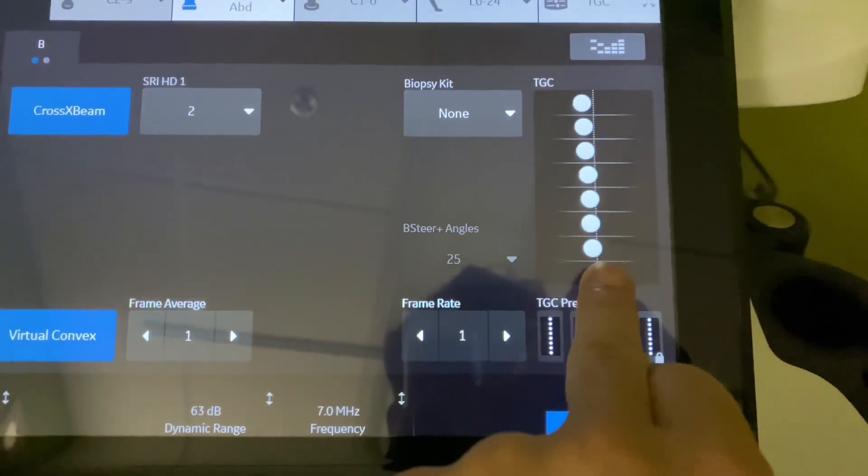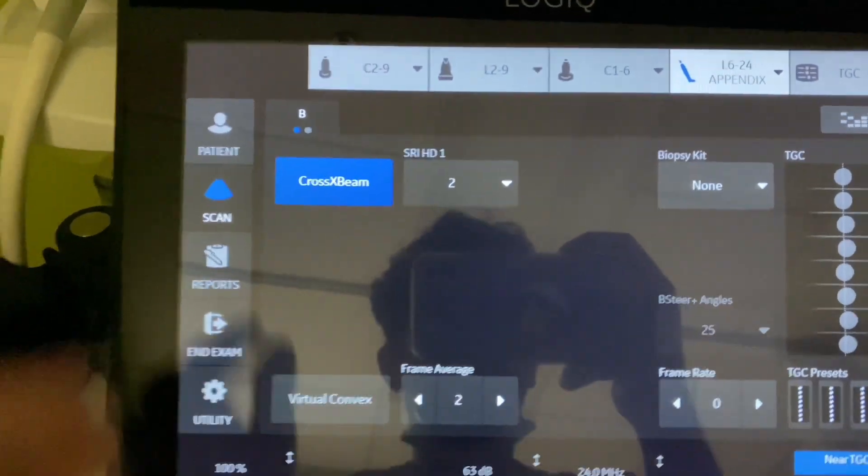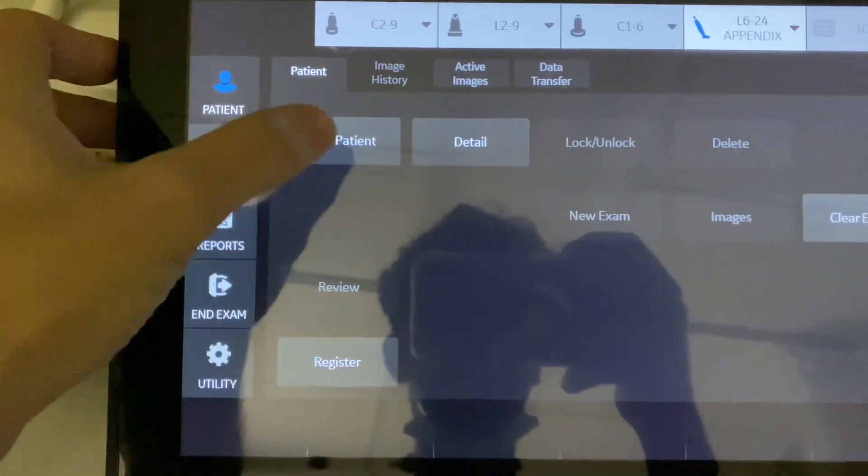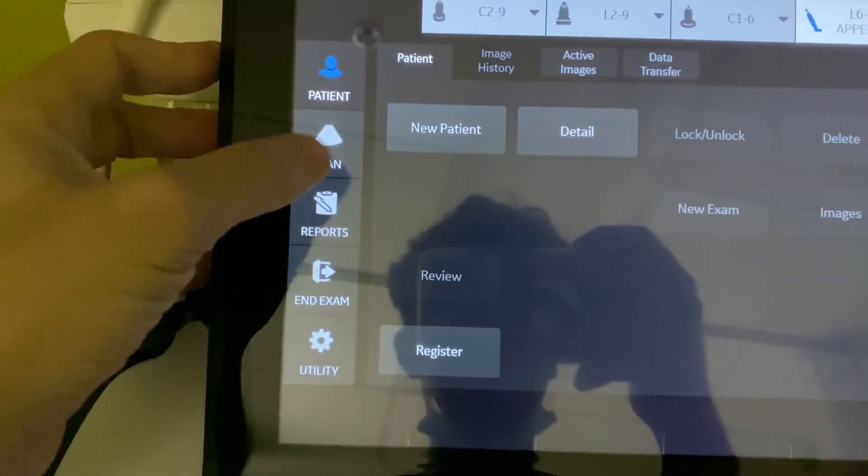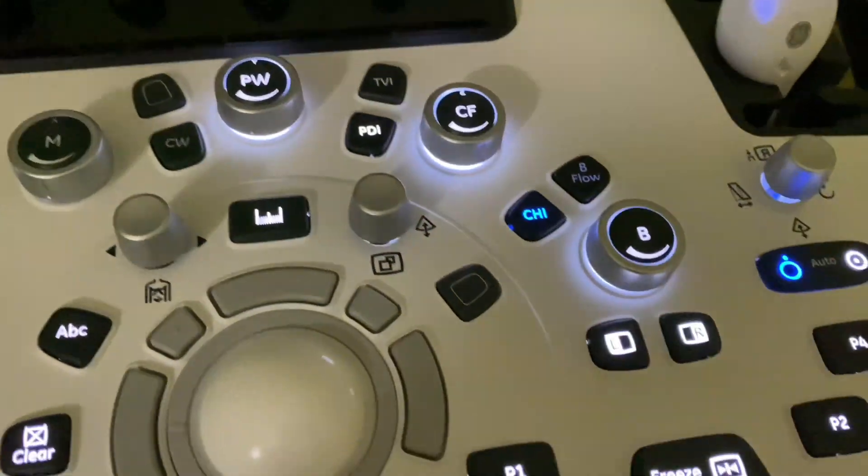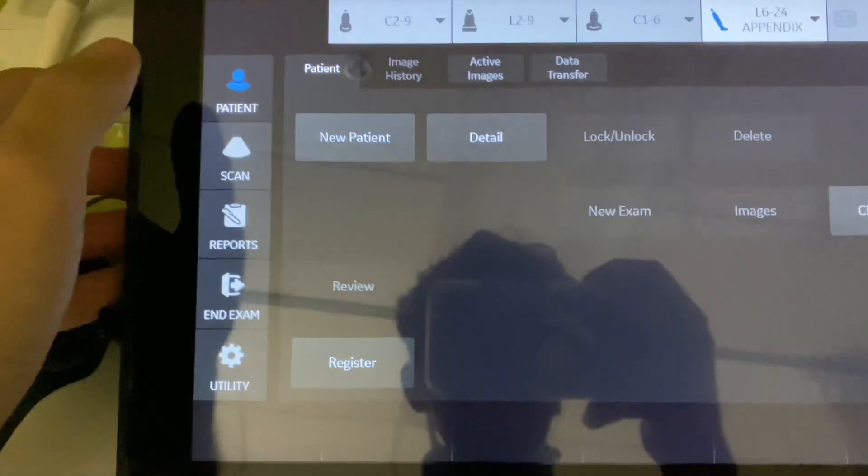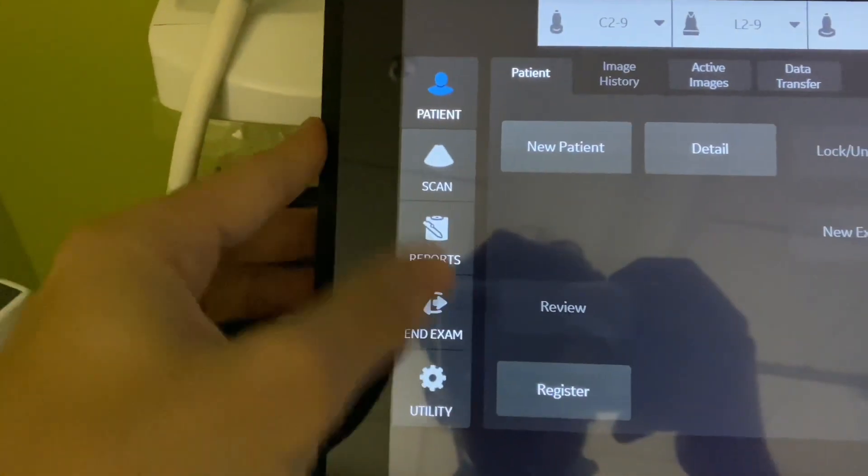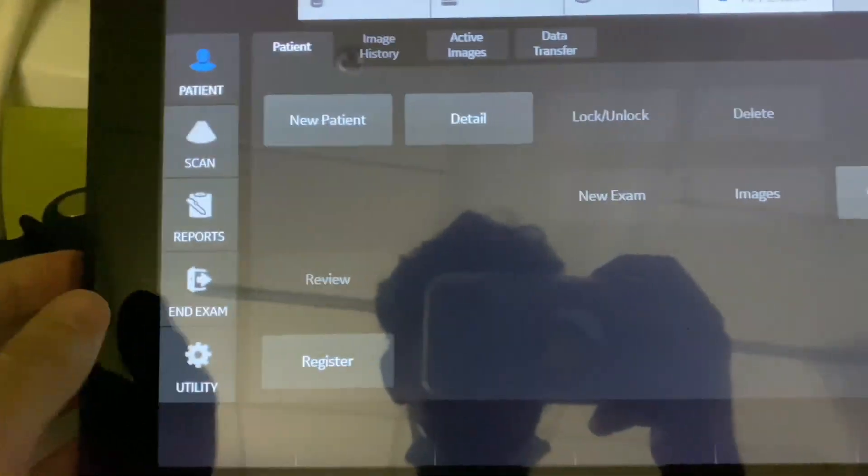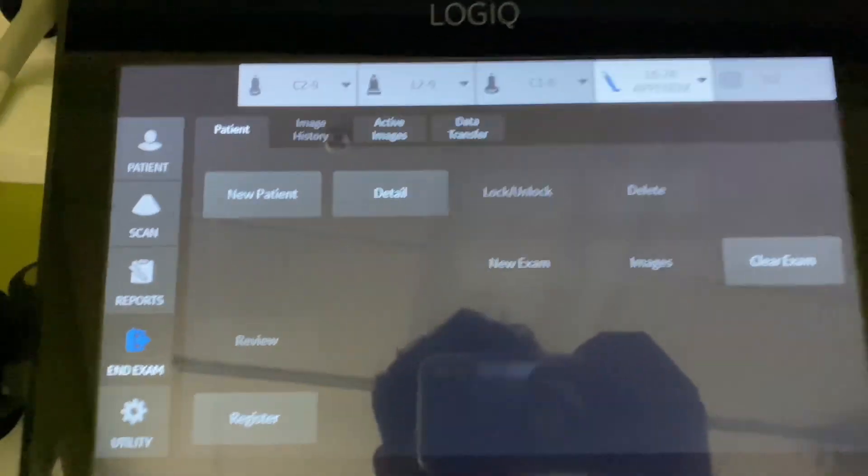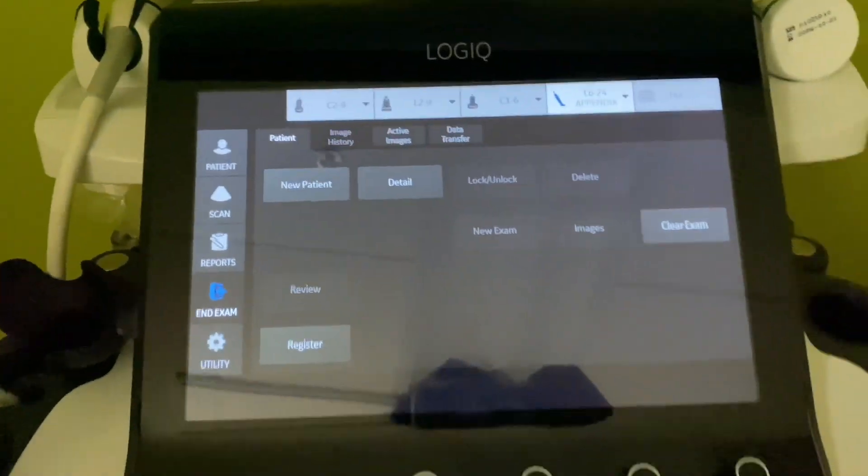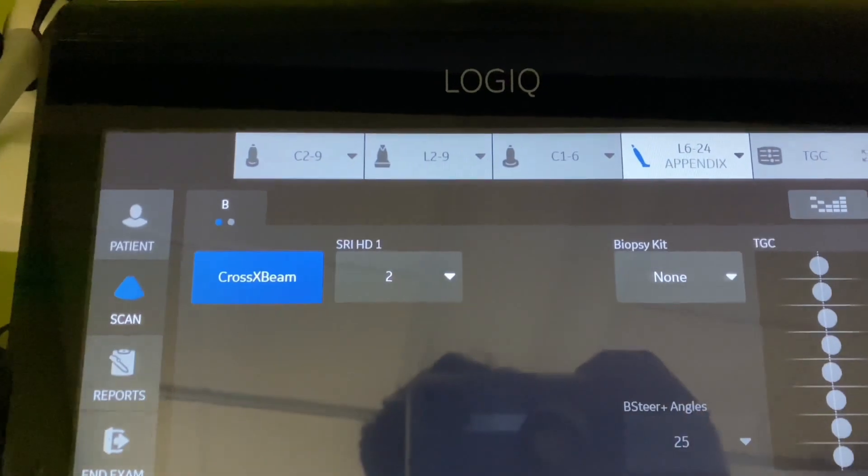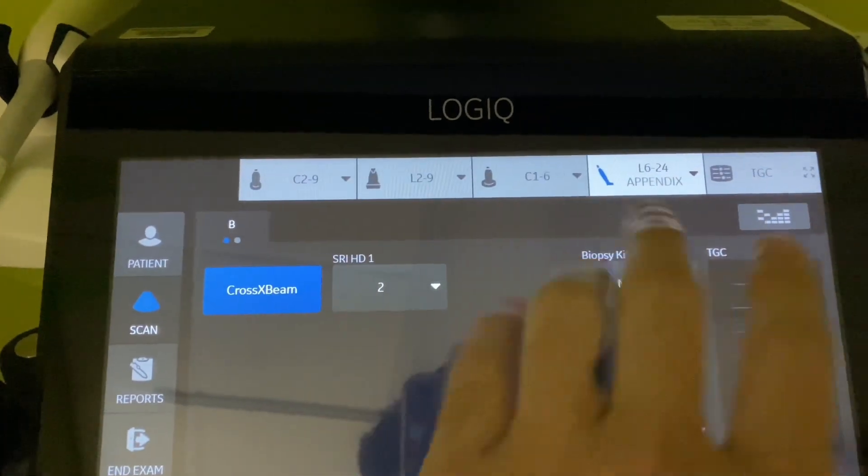All right, so not too bad. I guess I'm not a boomer after all. I can deal with that. Obviously you have the normal stuff: choose your patient, new patient, blah blah blah, all that stuff. Scan is the same thing as pressing the B button, is the same thing as pressing the unfreeze button. Let's see what else. Utility, that's to change all the parameters of the machine, and Exam is obviously to end the exam. All right, so the touchscreen is nice, looks like an iPad, looks like a Tesla.